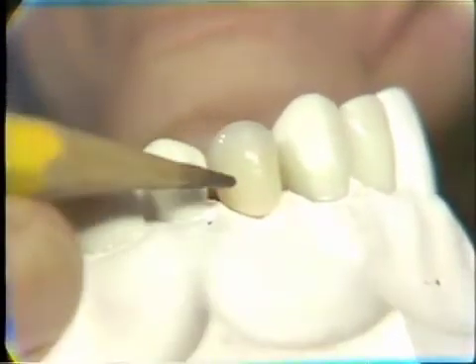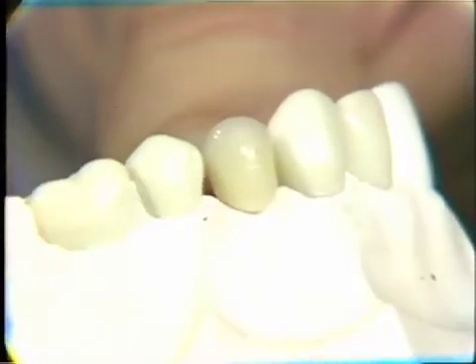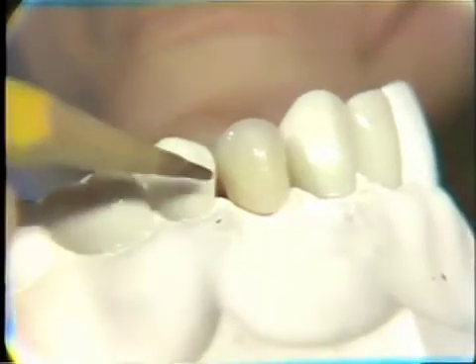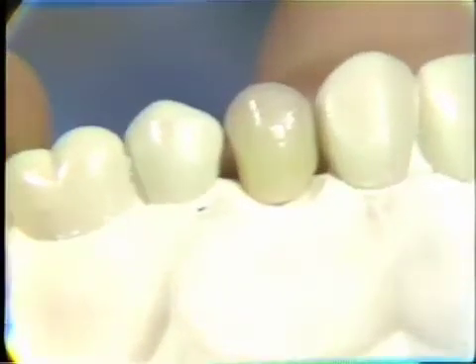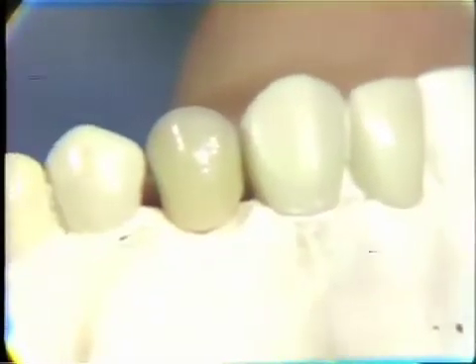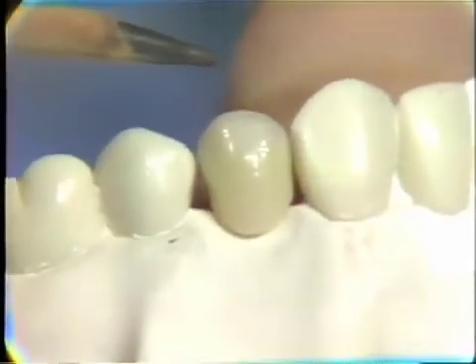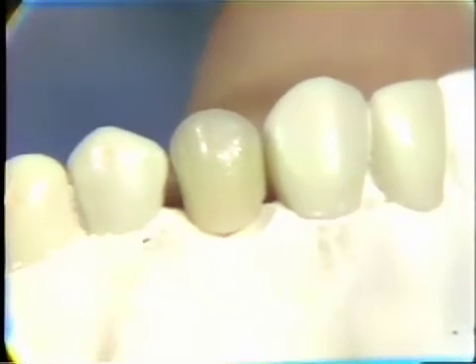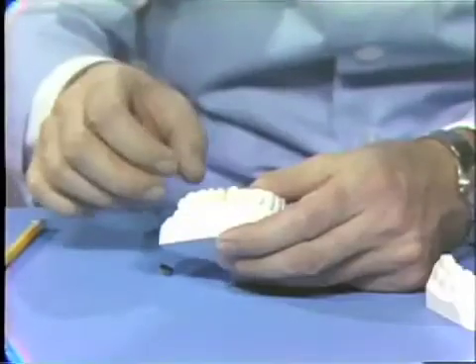And as we do that reduction down there, we also adapt it to the mucosal ridge and begin to develop our ridge lap relationship. I think you can see here that the embrasures are not sufficiently opened on the mesial and distal as we would like, and you'll certainly see the difference in the finished preparation. You can see also that this is the same length as the teeth on either side of it, and there's no room at the present time for the occlusal table on there with the gold casting on top. So our first step then is the adaptation for this vertical length.